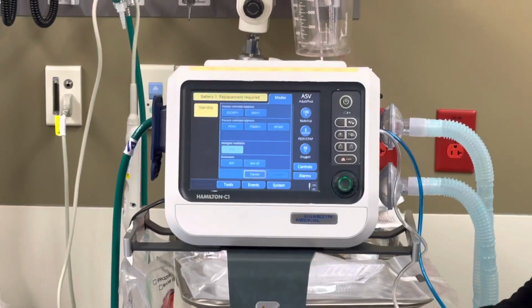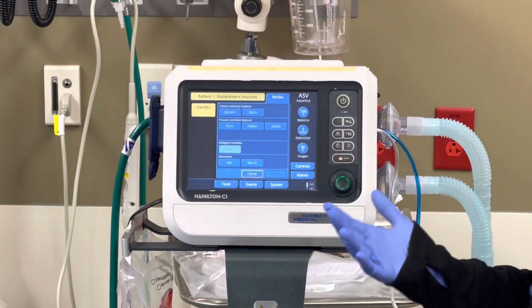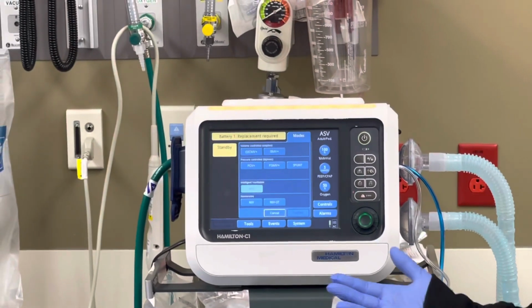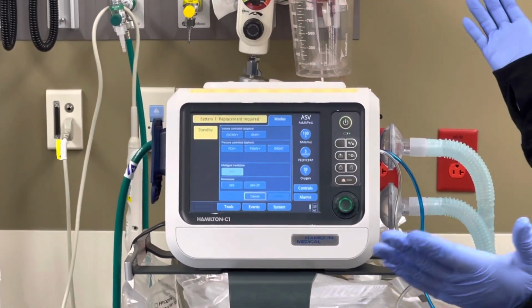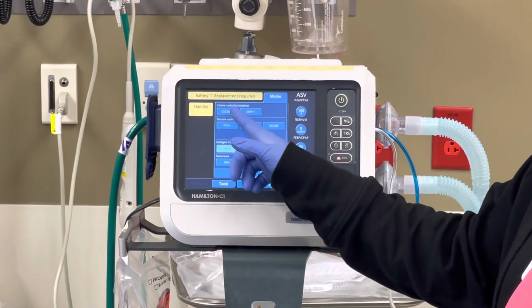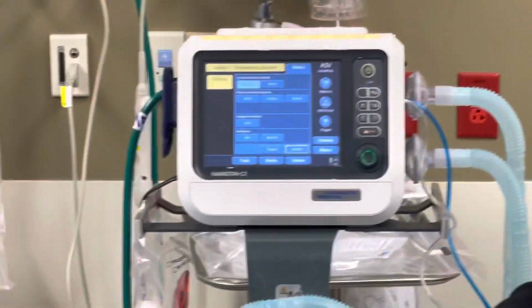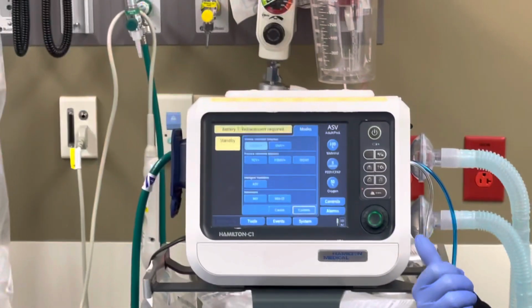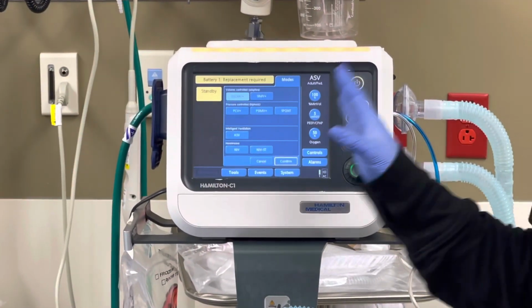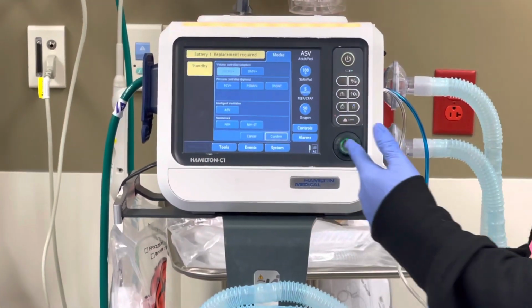So if you get a patient in, you're intubating them, it's an adult, say it's a male, approximately, let's say around 185, maybe say they're like 5'8", right? So we know the patient is intubated, so they're knocked out, we're not getting anything from them. I'm usually gonna pick a mode like AC mode, the CMV mode. What this is gonna allow me to do is choose everything that happens, right? The patient isn't going to choose. So even if the patient initiates a breath, they're still gonna get the full volume that I pick.